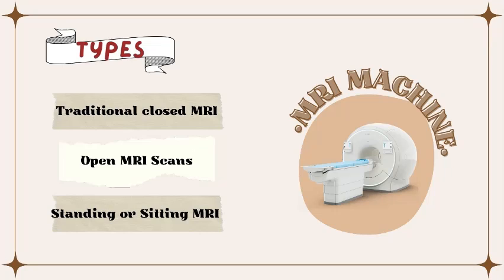The last one is the standing or sitting MRI. This comes from the desire to increase comfort in the development of MRI machines, but right now it cannot provide good image quality, so this machine is still in the process of improvement.